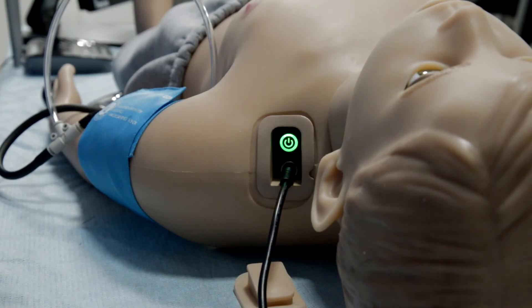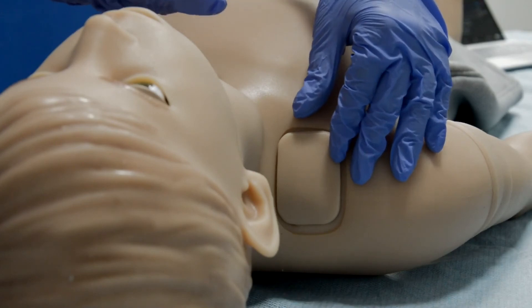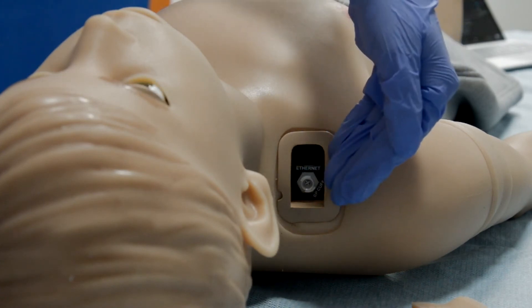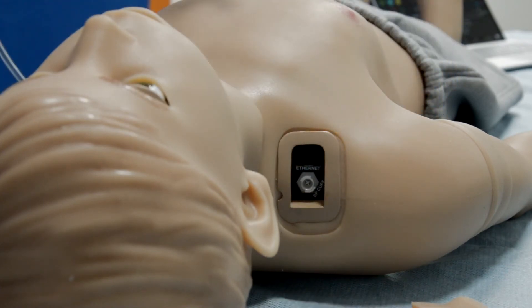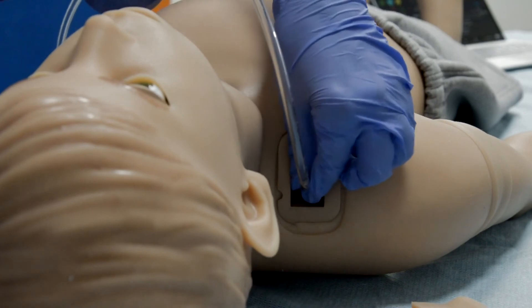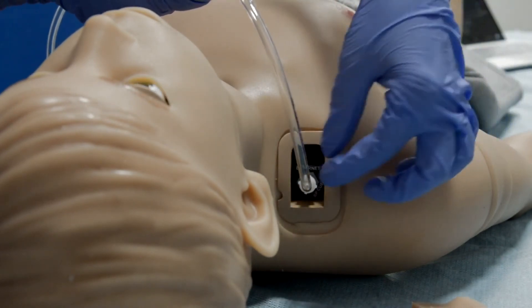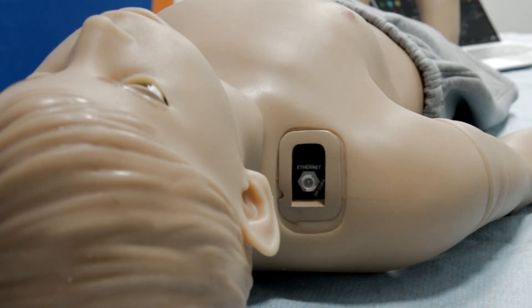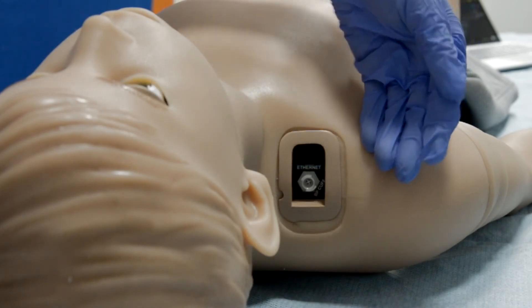Internal batteries provide eight hours of tetherless operation. On the right shoulder of the simulator, under the silicone tab, you will find two ports: one for Ethernet connection and one for the BP cuff. To measure blood pressure, insert the BP cuff tube into the port and rotate; to remove, rotate it back. In case of weak Wi-Fi signal or multiple interference, you can use an Ethernet cable to connect the patient simulator with your laptop.